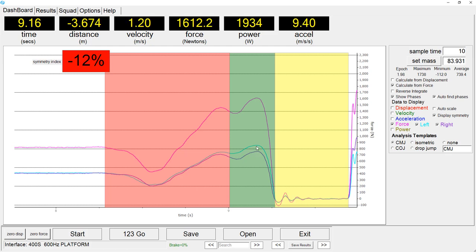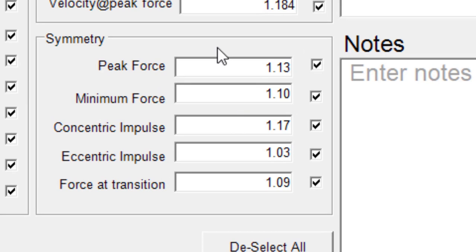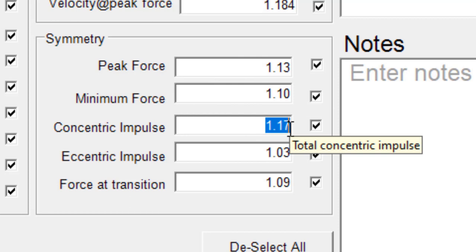If we then turn our attention to the actual results for a counter movement jump, we see that those differences are reflected here in the symmetry indexes. So the peak force, there is about a 13% difference in peak force, a 10% difference in minimum force. Both of these are favoring the left leg. And then we see concentric impulse about 17% higher on the left side.